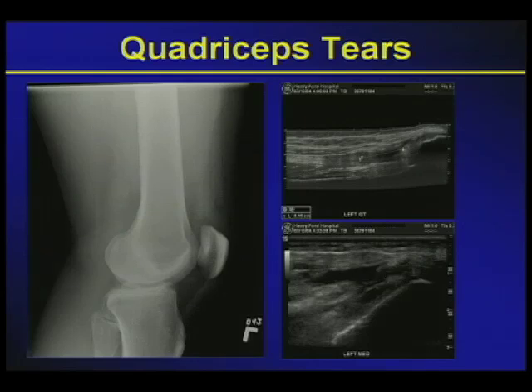Knowing musculoskeletal ultrasound and MRI gives a lot of people healthy respect of the baseline radiographs of most of these patients. Note that on the lateral radiograph of the knee, the left knee, a quadriceps tendon tear is easily suspected because of the suprapatellar effusion.